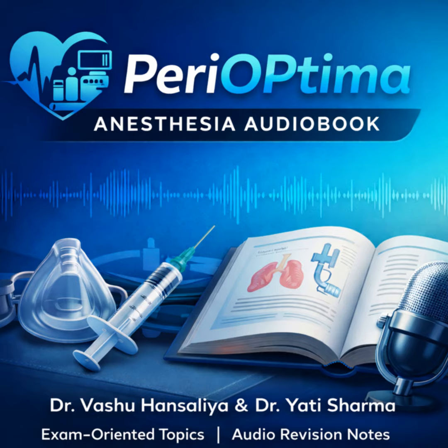They do. The core principle is total internal reflection. The scope is made of thousands of incredibly fine, flexible glass fibers, maybe 8 to 10 micrometers each. Very. And they're coated. When light enters one end at a shallow angle, it just can't escape the sides. It reflects internally along the whole length of the fiber and comes out the other end unchanged.